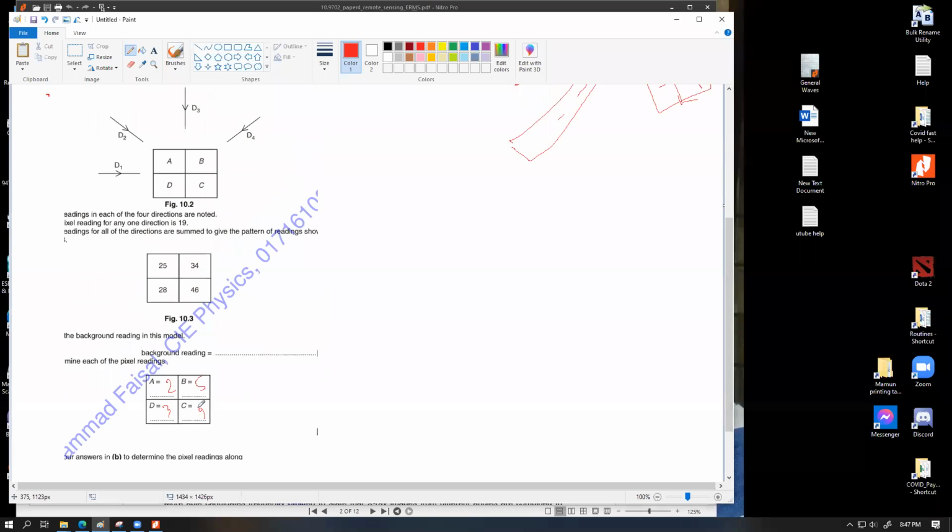That's good. And then for the D4, if we go for this diagonal relation D4, that is this one, we're gonna get 2, 8, 9. So starting from the very left, we're getting 2, 8, 9. And now this scan value would essentially be obtained in a diagonal set of values like this. So 2 over here, 8 over here, 9 over here.